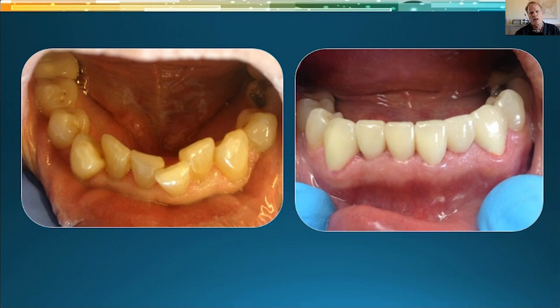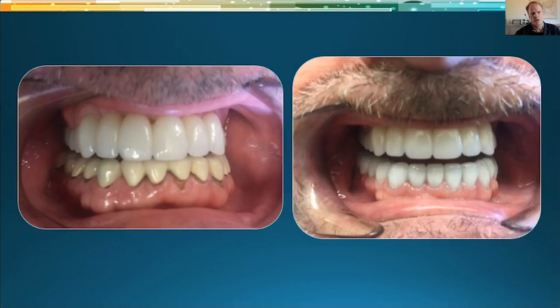But before, when I had air-driven, I didn't even think of these things sometimes, replacing all these crowns, these PFMs, all at once. When we used to cut gold off, it was really quick and simple. You just score it and pry it, and it comes right off. Then PFMs were a little harder to cut off. And now if you have to cut off bonded zirconia, good luck. That forced me into electric handpieces and quality burs and single-use burs.